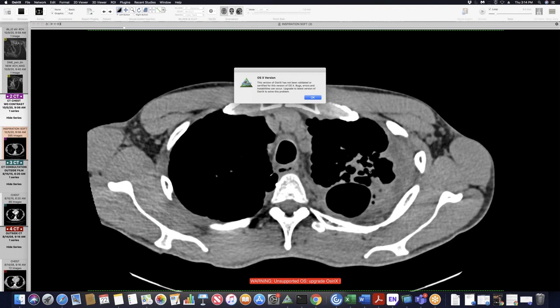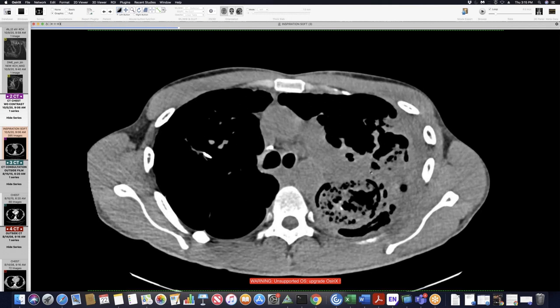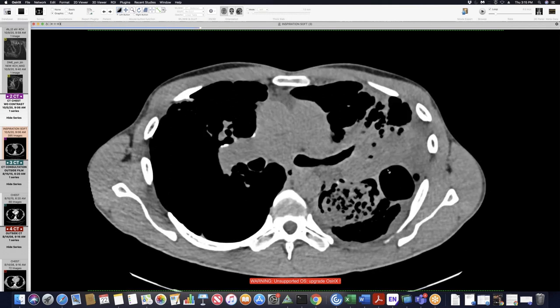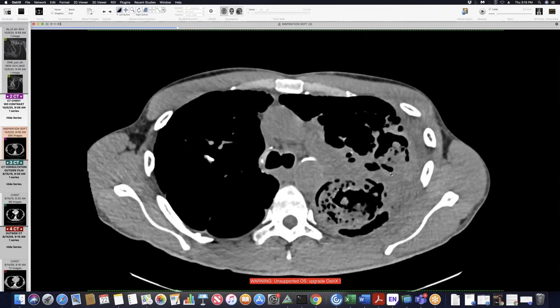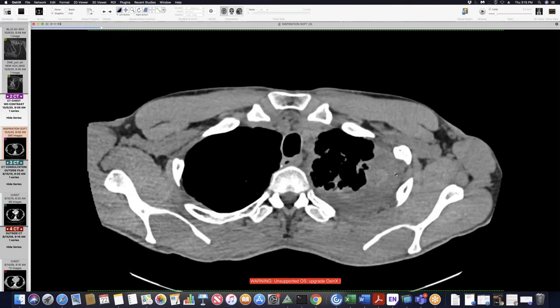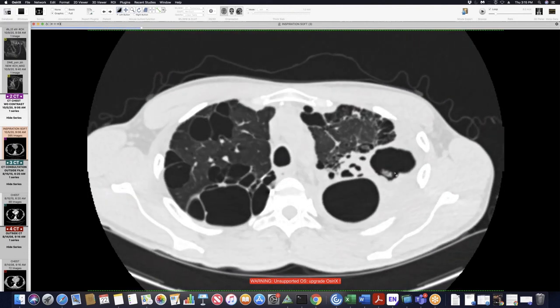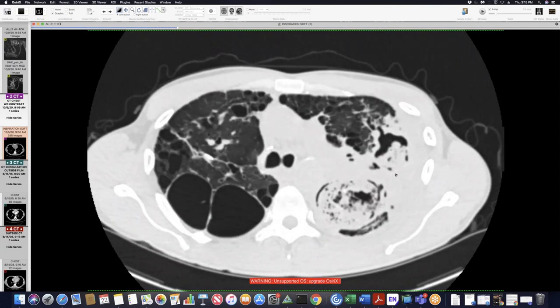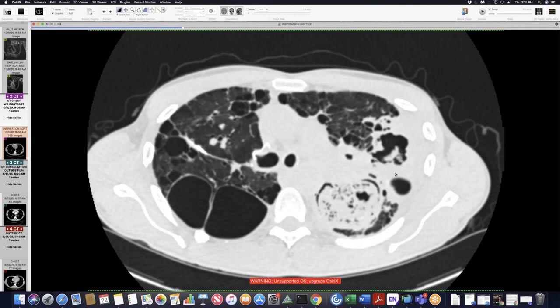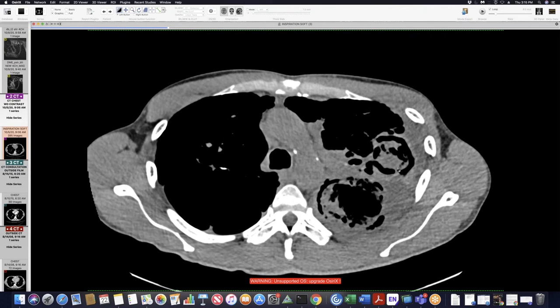Yeah, you're showing mycetomas here, right? Yeah, but I thought this gentleman would fit for the mildly immunocompromised because he's on steroids, and basically his lungs are destroyed up here. And then he had a positive galactomannan. So when you say positive galactomannan, you mean in the blood? Yeah. Okay. I wonder if he had an eosinophilia and IgE elevation too, because the presence of aspergillus in these cavities can lead to an allergic response. It's like ABPA. Mm-hmm. And sometimes it's that sort of allergic phenomenon that causes the wall thickening around the cavity that houses the mycetoma.